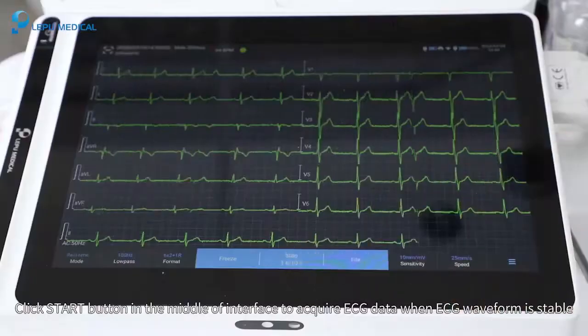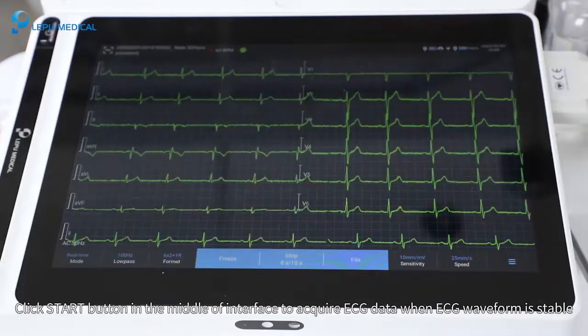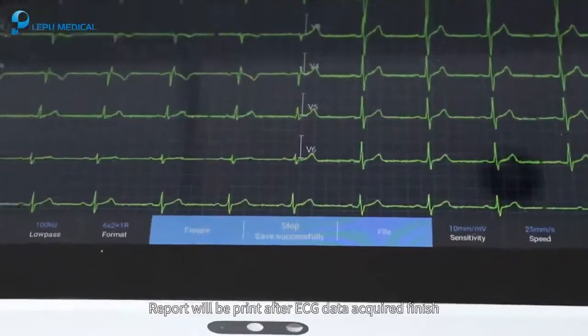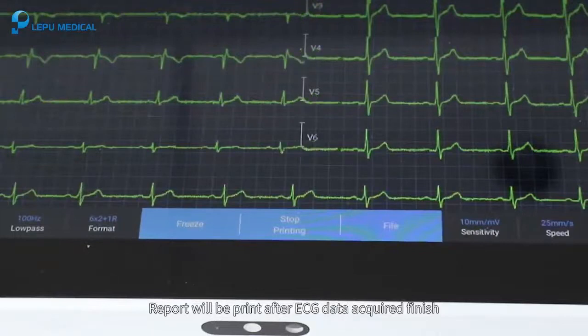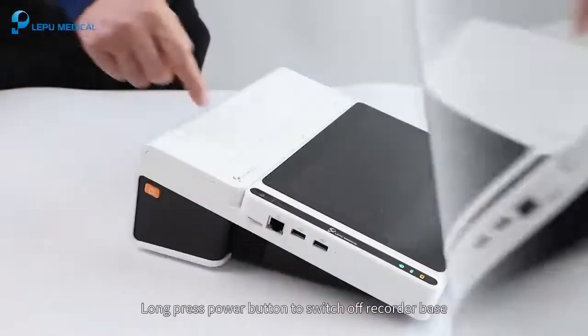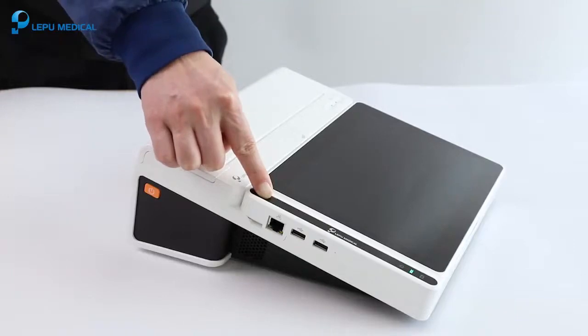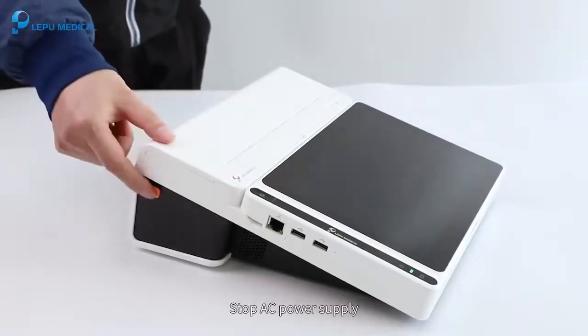Click the Start button in the middle of the interface to acquire ECG data when the ECG waveform is stable. The report will be printed after ECG data acquisition finishes. Long press the power button to switch off the recorder base. Stop AC power supply.